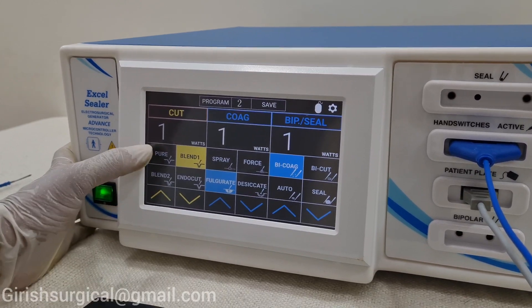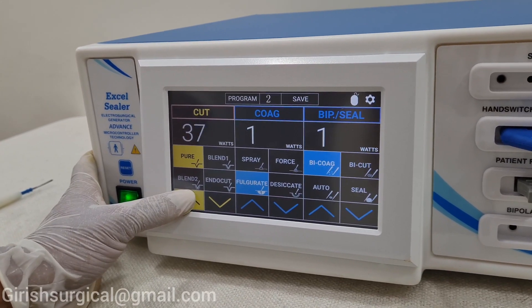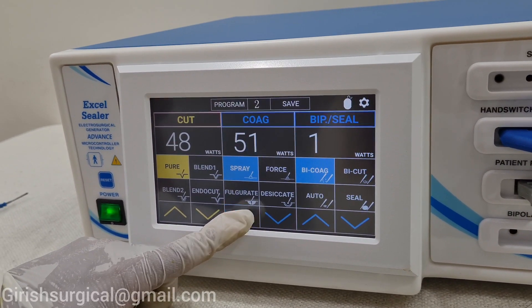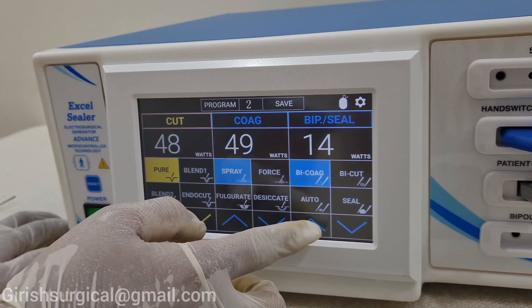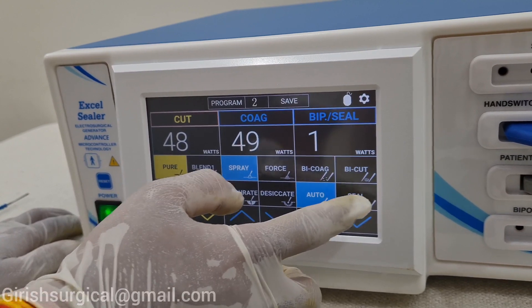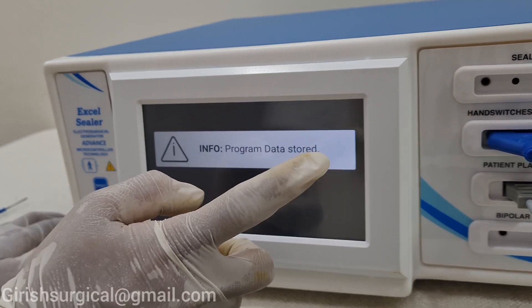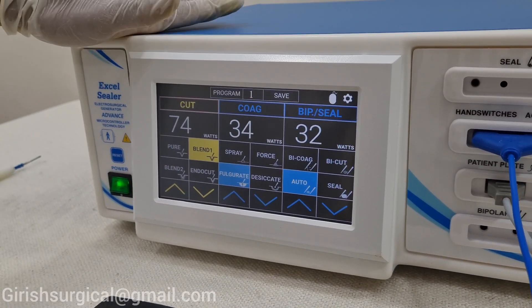Now we will try program number 2. On pure cut, the output is set to 48. The coagulation spray mode we will keep at 51. The bipolar and seal — we will keep it on bipolar coag mode. You have to press according to your requirement: if you have auto mode, seal mode, or bicoag mode. We are doing it on bicoag mode — bipolar coagulation. We had set this and just pressed save. Program data stored.